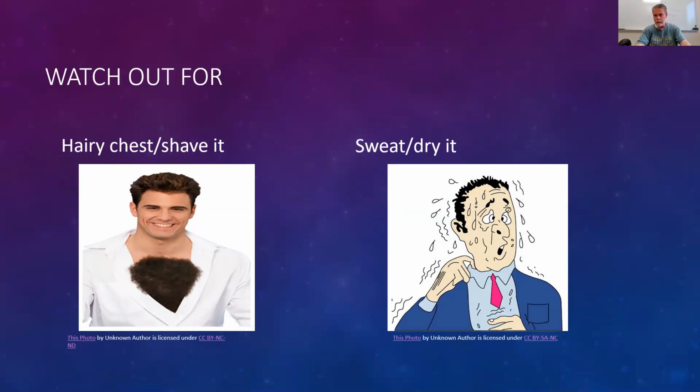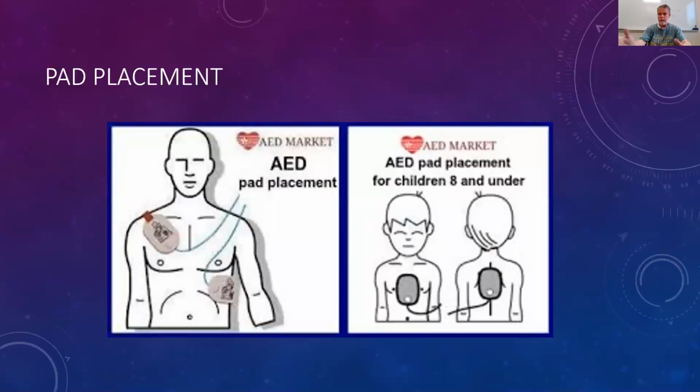I know just looking at the pads I gave you may have been a little difficult to ascertain that placement. So I wanted to put this up as well, right? But all of the pads that you have for AEDs actually do have those pictures. That's why you can see it goes here, it goes here. Just remember, turn it on, follow prompts, and then we hit the shock button if indicated.